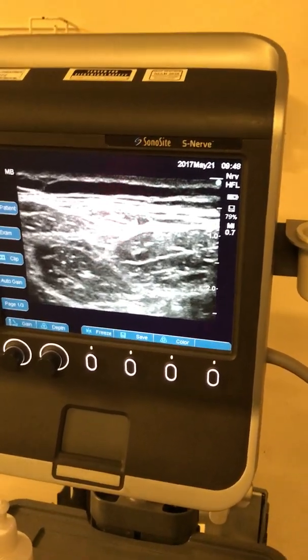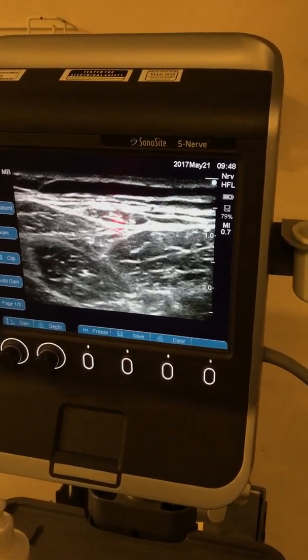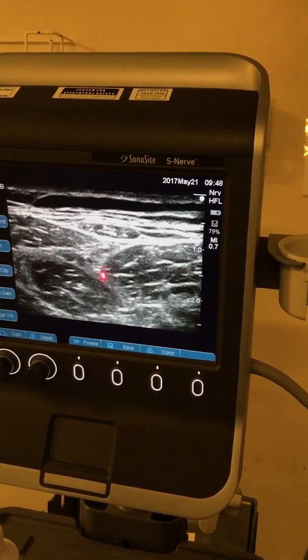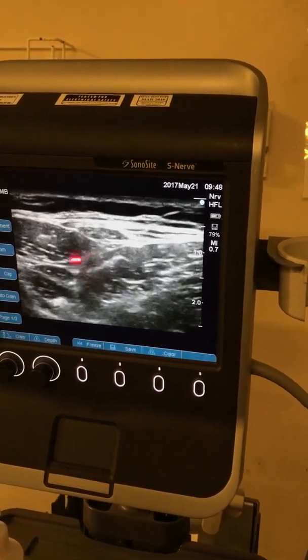That's your fascia latae. That's your lateral femoral cutaneous nerve of the thigh. That's your sartorius muscle. This is sartorius, this is rectus femoris, and that's your tensor fascia latae — TFL.